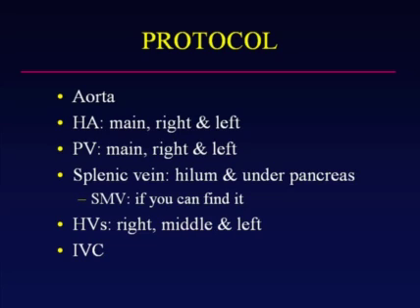And I do want to emphasize, particularly if you're evaluating a patient status post liver transplantation, that it is very critical to identify and obtain a spectral Doppler tracing of the waveforms in the intrahepatic right and left hepatic arteries as well as portal veins. So just seeing the main hepatic artery and portal vein is not enough.